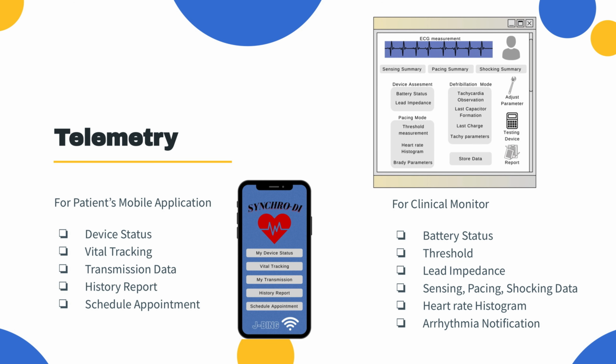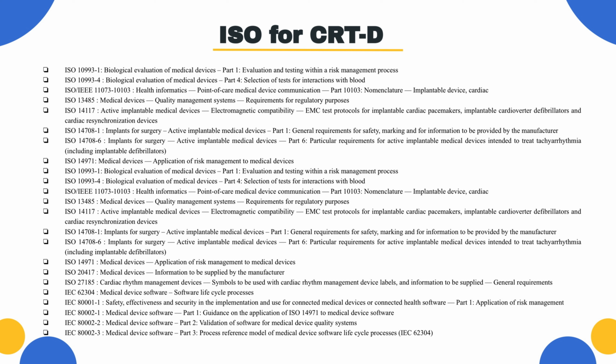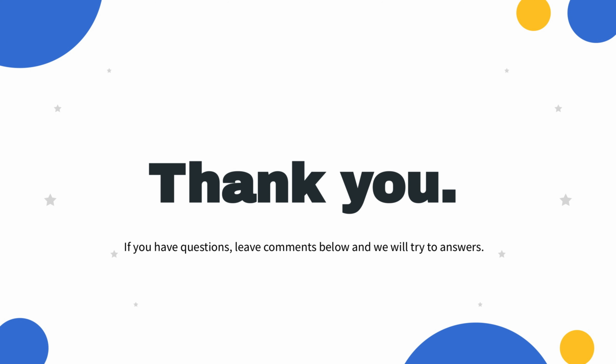For the telemetry system, external communication is supported by the device via wired, Bluetooth, and radio frequency. The device can send both diagnostic information and a real-time electrogram to the patient's smartphone and clinical monitor for the physician to follow up. Remote monitoring of patients improves survival and identifies risk markers of mortality for the patient. So this is the list of ISO regulations for the CRT-D device. This is the end of our presentation.